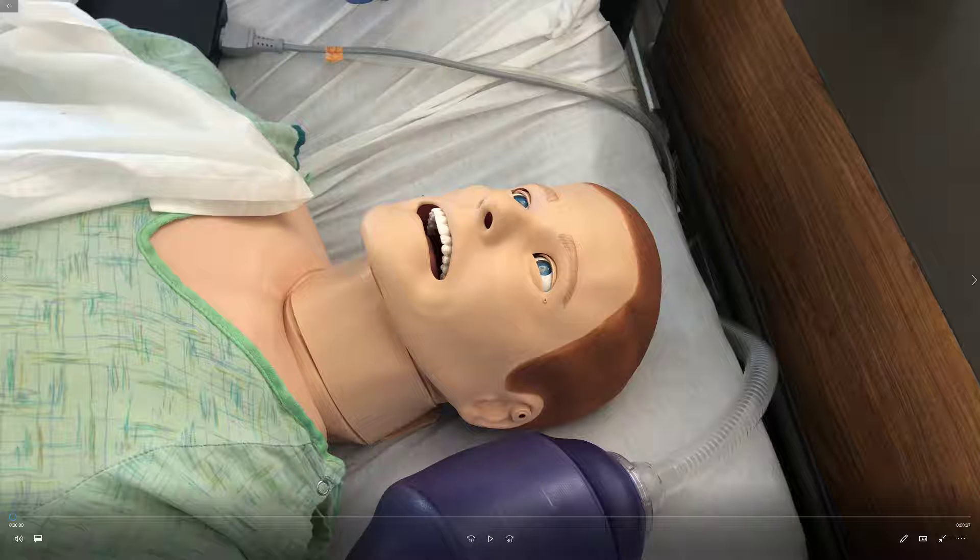Now we're going to talk about the next piece of equipment: the BVM, or bag valve mask. It's something you've probably all seen before, and maybe even used yourself, but we're going to go over it to make sure you know how to use it if the situation were to arise in the back of the MSU.